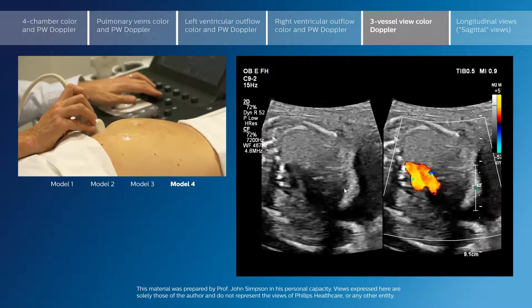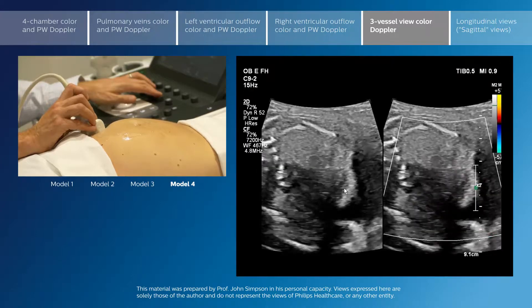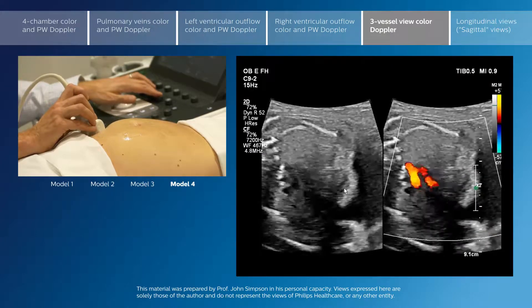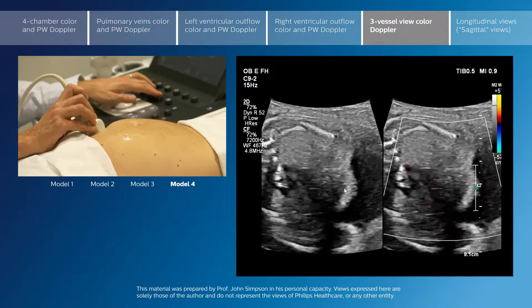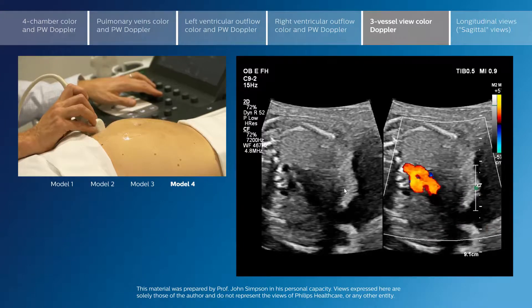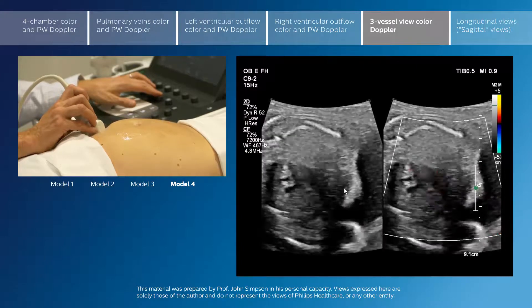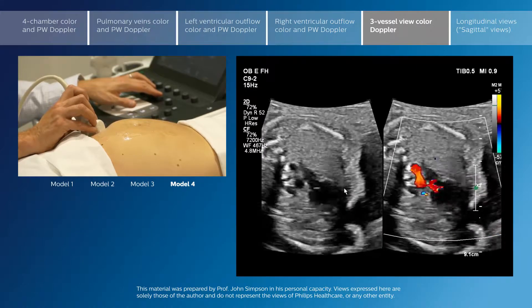This would result in one vessel in this projection showing red and the other vessel showing blue, indicating reversal of flow. That is never a normal finding in this projection.